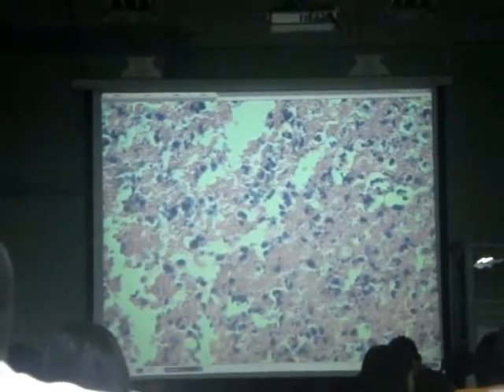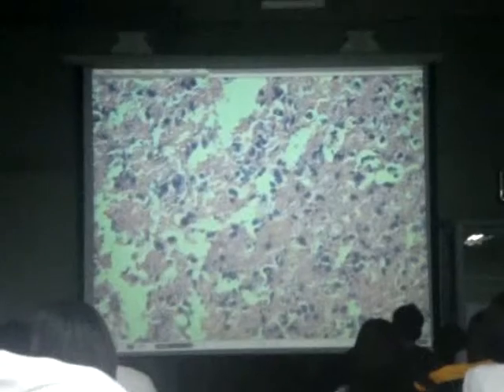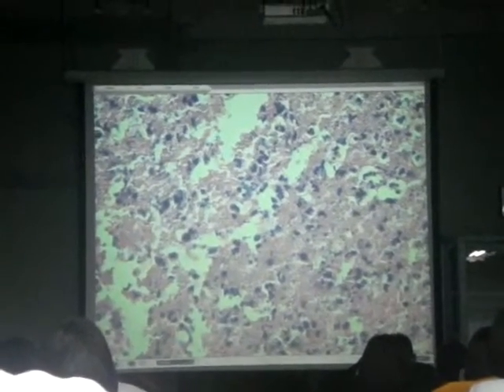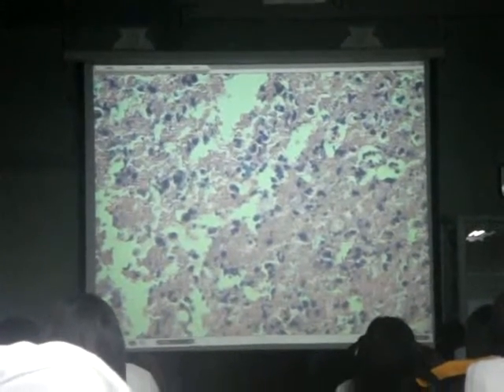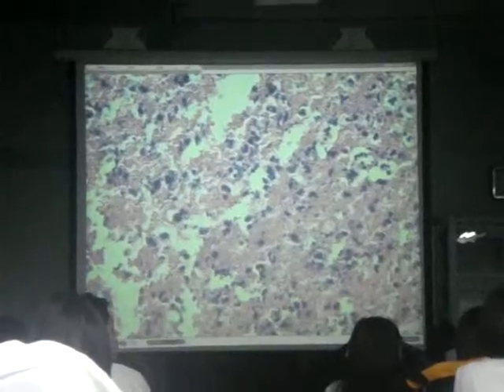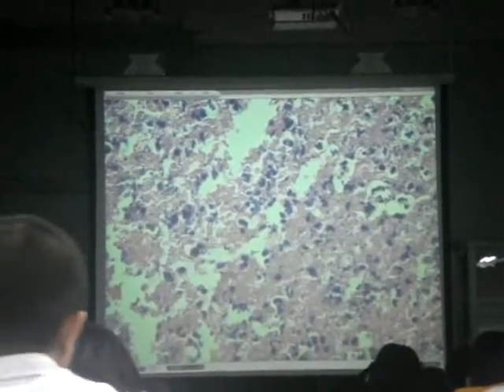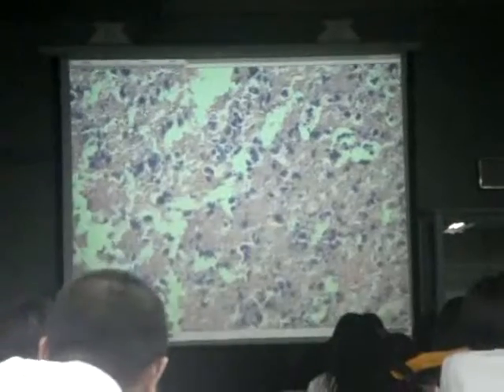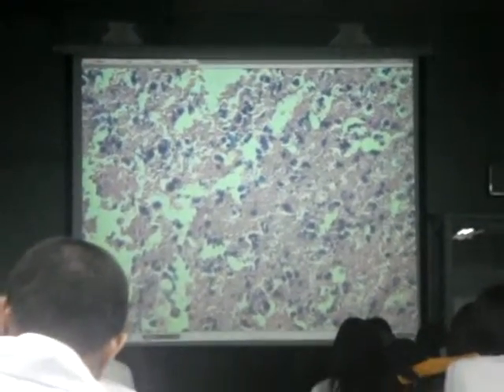You know that you're in the epididymis. Are these normal structures in the epididymis? Are those sperm cells? Are these normal structures? So, parts of the epididymis seem to have been replaced by this material. You don't see a pore, you don't see any glands, you don't see the lining epithelium.